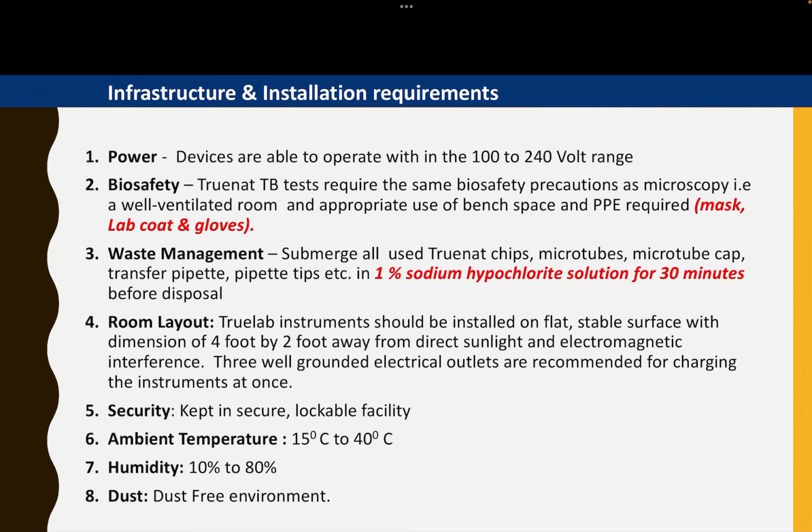Now coming to biosafety. It does not require much biosafety. The ones which you use for microscopy is enough. So bench space and PPE, personal protective equipment, is required. You have your mask, your lab coats, and your powder-free gloves. Those are enough. Waste management: all the things which are used here, the tips, chips, everything has to be dipped for 30 minutes in 1% freshly prepared sodium hypochlorite solution.